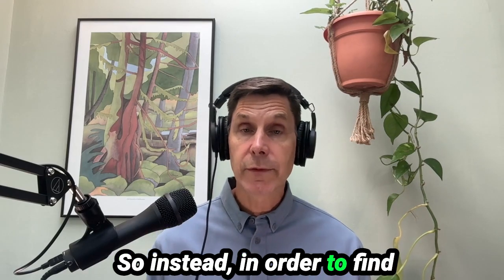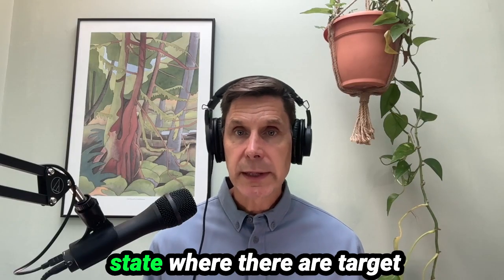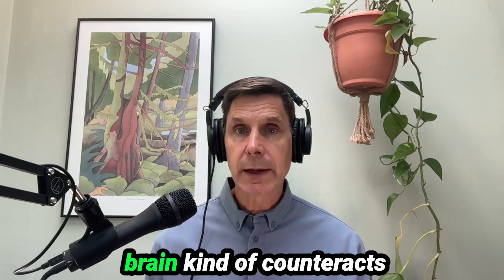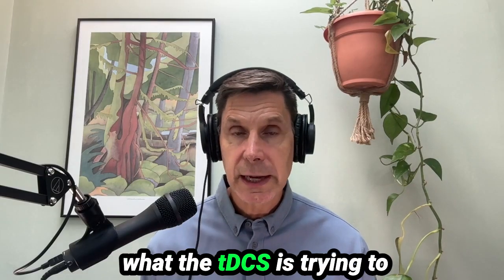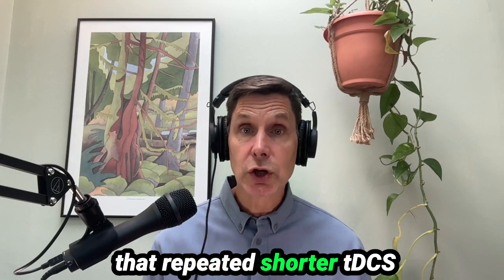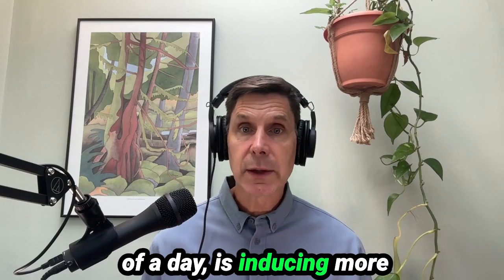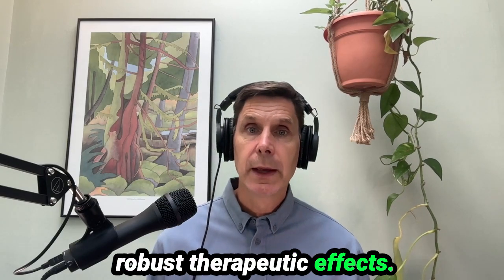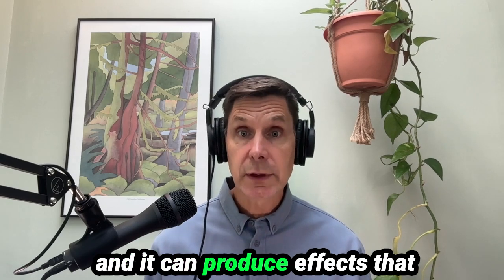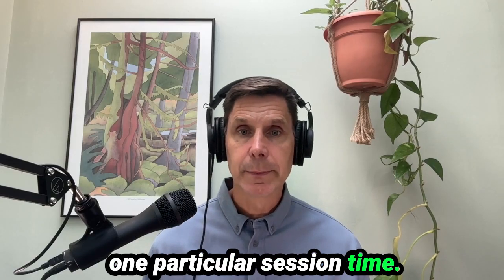So instead, in order to find the sweet spot in between those two states, the normal state where there are target symptoms and the excessive tDCS state where the brain kind of counteracts what the tDCS is trying to do in a therapeutic sense, what is being shown is that repeated shorter tDCS sessions over the course of a day is inducing more robust therapeutic effects. And so this is what's known as within session repetition, and it can produce effects that are lasting up to 24 hours in one particular session time.